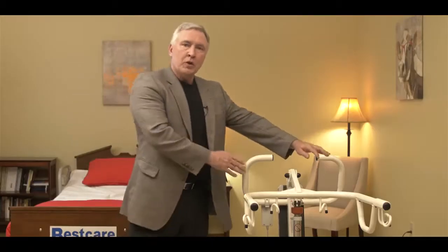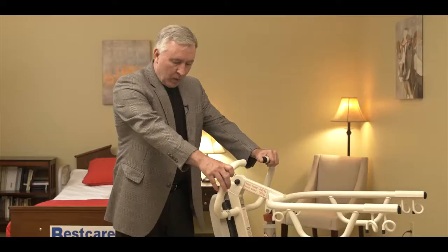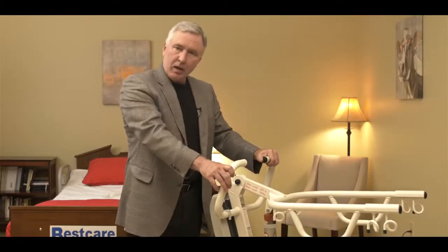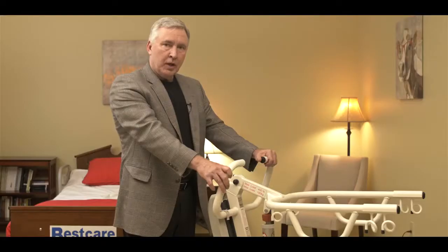Now let's go ahead and show you how to operate the lift. You can see that the lift rolls around on four wheels. We've got two locking casters in the back. Push the tab to lock, push it again to unlock it.